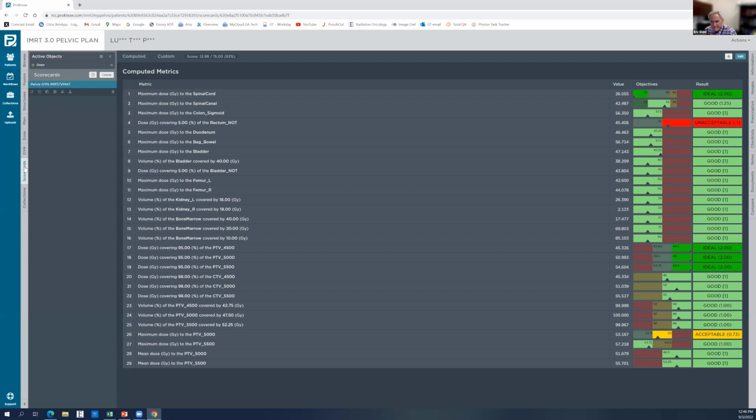So it's rare. Like I said, we will occasionally on some really complex and long cases, or with the nodes in the middle and then big volumes, we might do a VMAT. But our physicians don't routinely do it, and then you do start to see your lung dose kind of creep up a little bit. So it's not our practice. I know a lot of places do IMRT and VMAT for these, and if it works, that's fine. But it's just not our physician norm.